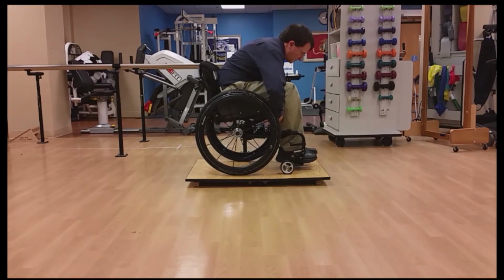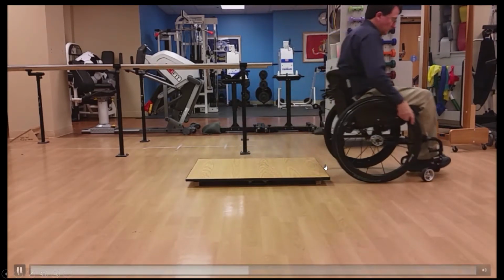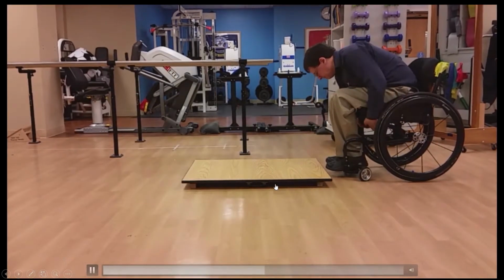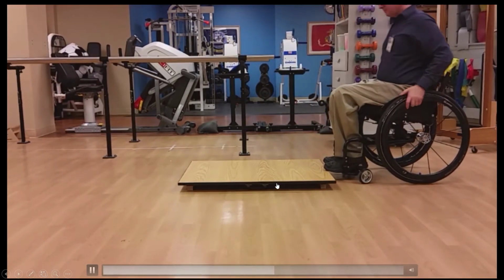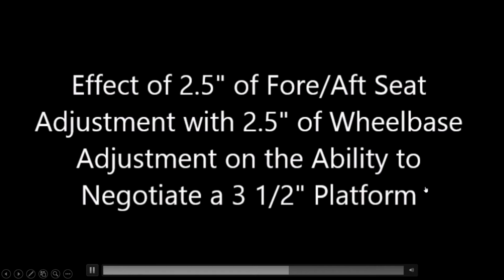So one of the take-home points from this, Rachel, if you'd like to. Sure. Steve and I are not suggesting that you give everybody back or front heavy chairs, but just be aware of what you're doing and how you can set somebody up for success by teaching them the right skills or looking at them in the chair, not just, okay, the chair's exactly where their fingertips are, but what does that really mean as far as can they negotiate something that they need to do, and if they can't, then what are you going to do about it? Yeah. Or if they're not in the built environment in other countries.